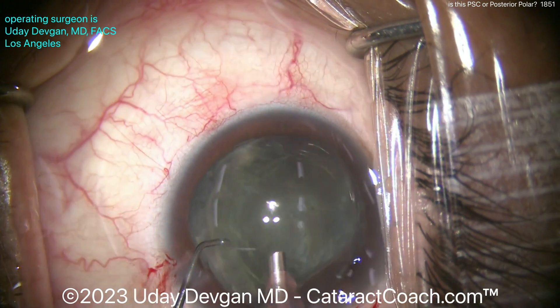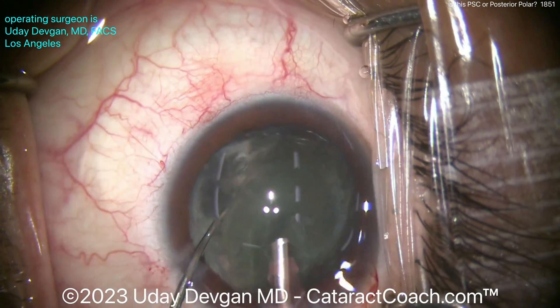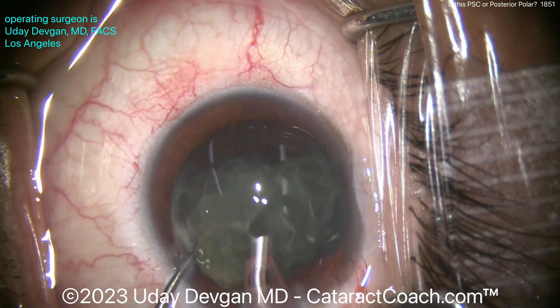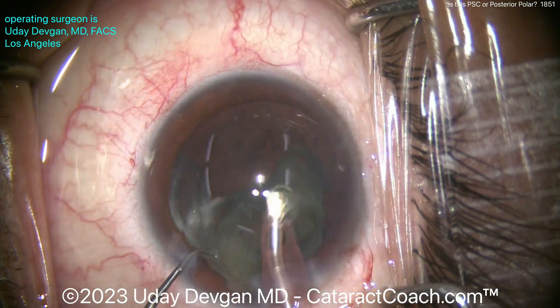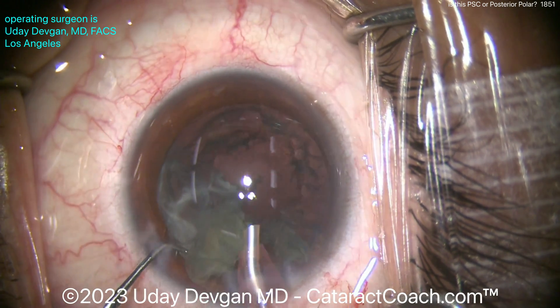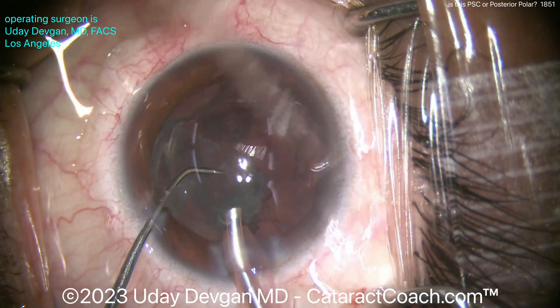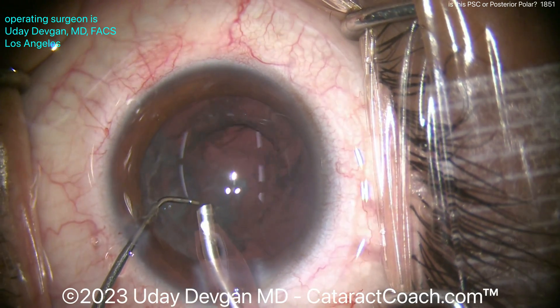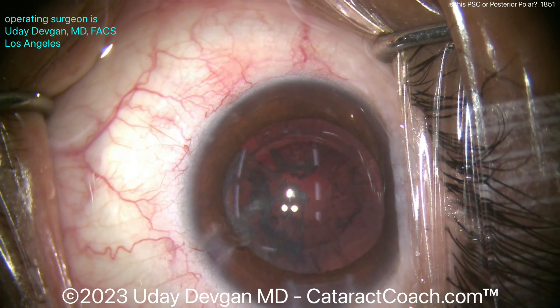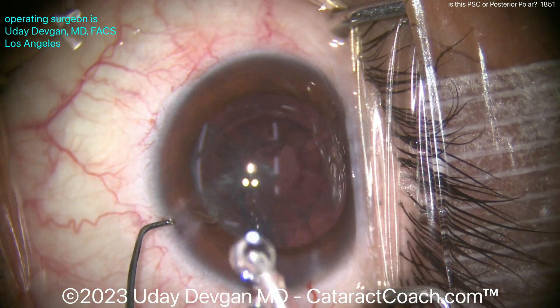Now going in with the phaco probe, we can just aspirate the central endonucleus down — take that down nice and easy. The key here is to get it out of the bag quickly, aspirate it down. It's actually very soft. And then as soon as we get a glimpse, let's look back there — how does the posterior capsule look? Do we see anything going on there? It looks pretty reasonable. Maybe this was mostly posterior subcapsular. So I'm even brave enough to come out of the eye without letting the AC collapse much.